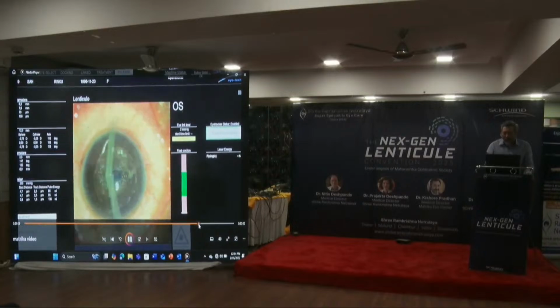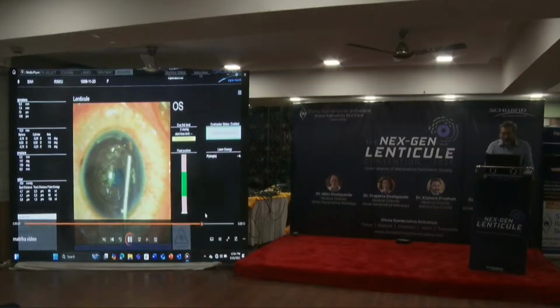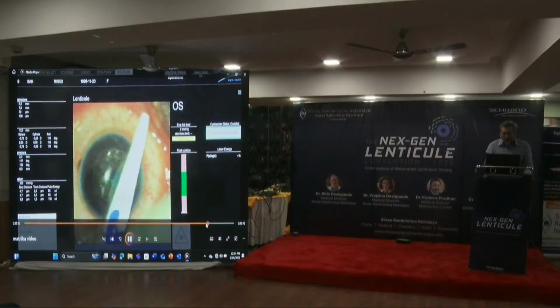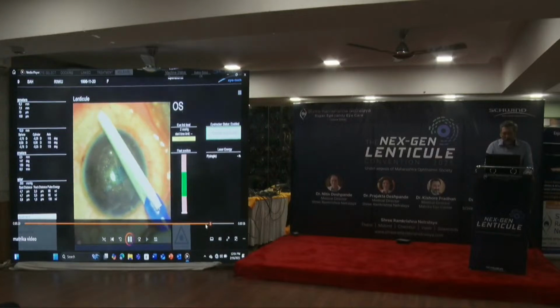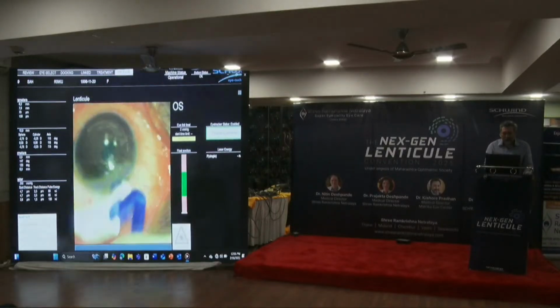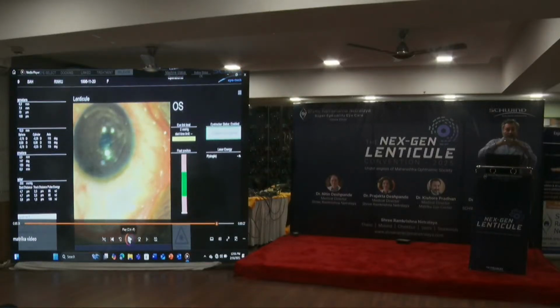What I'd like to do is iron the cornea with a dry sponge. I don't know if I've shown it here. Absolutely smooth. What we do, I just iron the Bowman's membrane. Looks absolutely smooth. If I want to check, what I'm looking for is any mud cracking. Look down towards your foot.